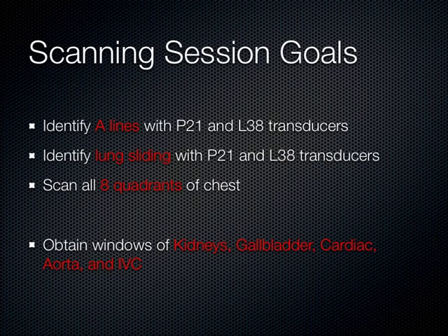And with what time you have left, practice your views of that pleural space. Look for fluid in the pleural space, Morrison's pouch, spleen and renal recess, and anything else that you feel like you need to review, because you'll have extra time today.